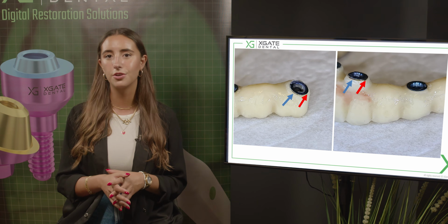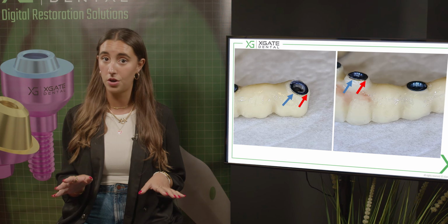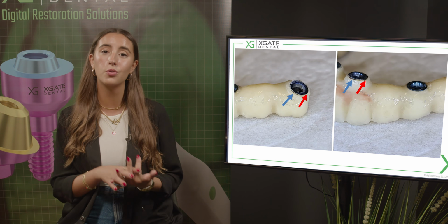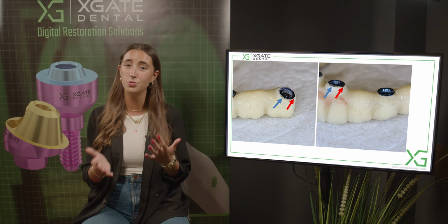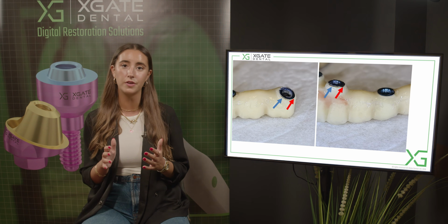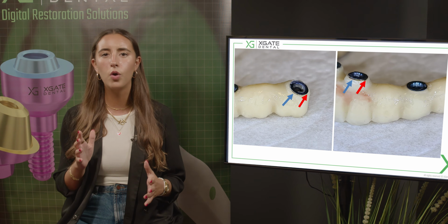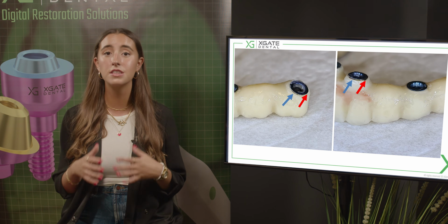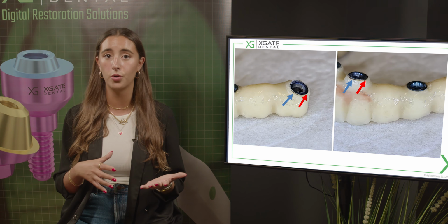You can see in the posterior part that the gap is not very small. In this case, if you wanted to make a zirconia bridge and then attach the zirconia bridge to the multi-unit, you probably would have a problem. It's not a large deviation, it's like 0.1 or 0.2 millimeter. And all of these deviations are because of the cementation process.